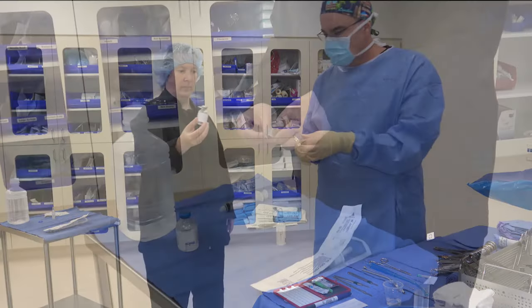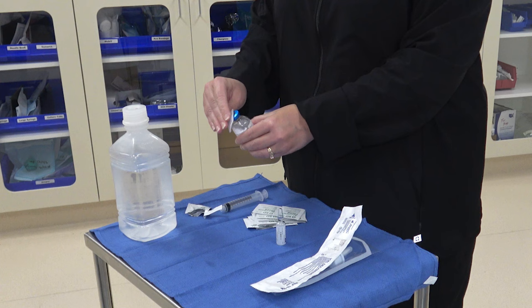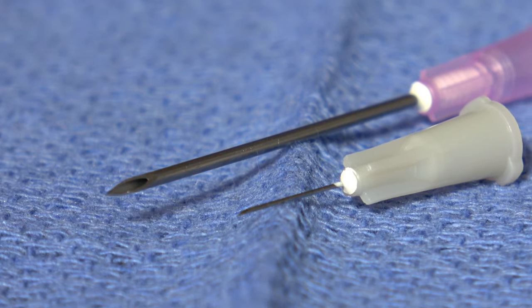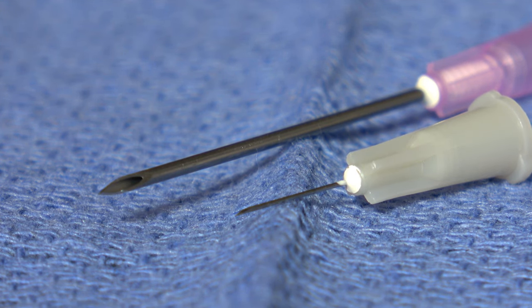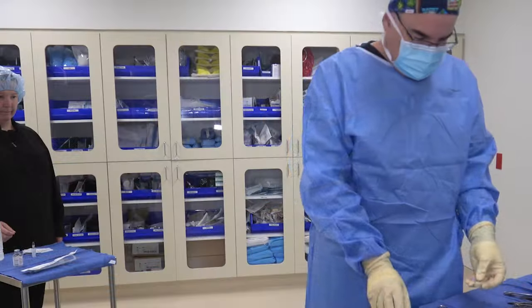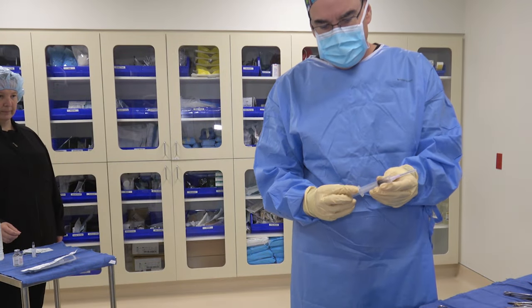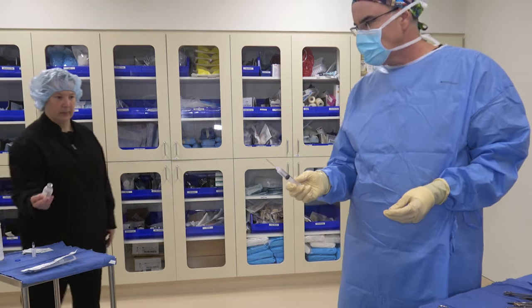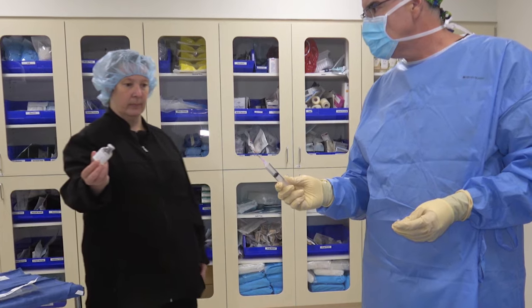In the third method, you will draw the medication from the vial that the circulator is holding. The circulator will remove the cap and wipe the top of the vial with an alcohol pad. You will place a large bore needle, like an 18-gauge needle, onto your syringe — this large needle makes drawing up medications easier. You will remove the cap and pull the plunger back about halfway.